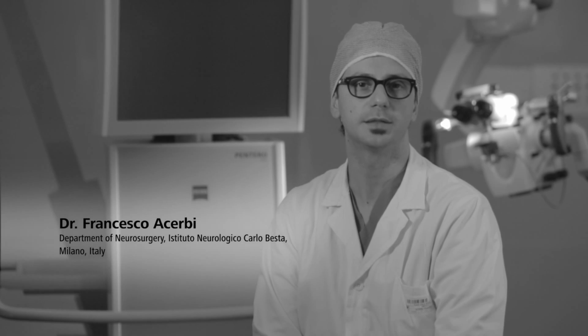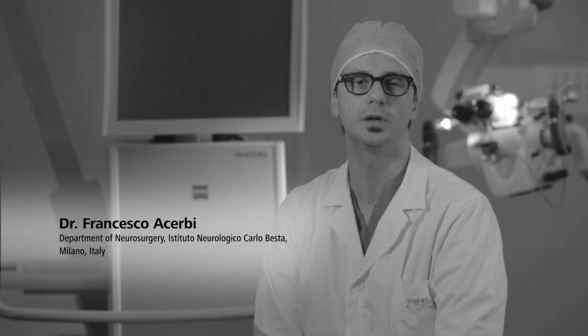With the ICG technique, you could just evaluate vessel patency and you have no information about the flow inside the vessel. You are able to visualize and to calculate in a semi-quantitative manner the flow inside the vessel exposed during the craniotomy.